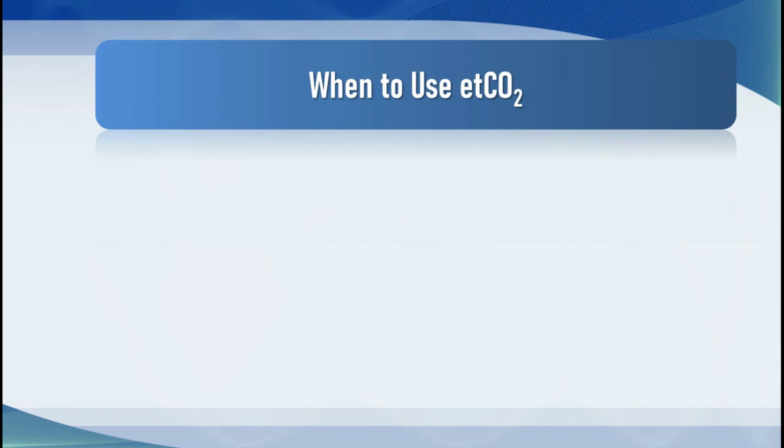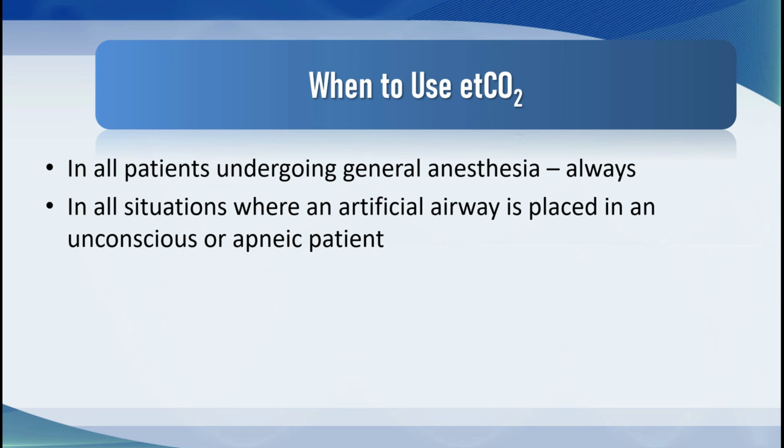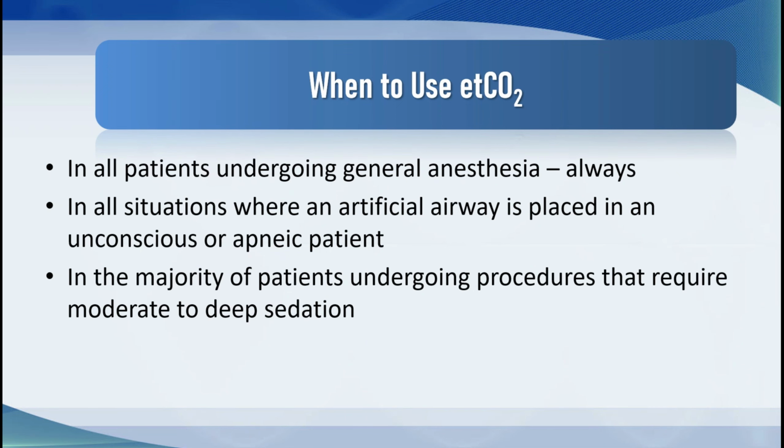It's important to remember that we use end tidal CO2 monitoring all the time in our practice. It's mandatory in patients undergoing general anesthesia, and I think it should be used in all situations where an artificial airway is placed in an unconscious or apneic patient, and probably in the majority of patients that require moderate to deep sedation.